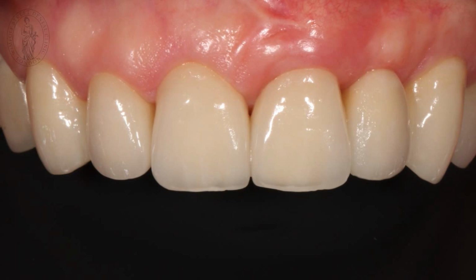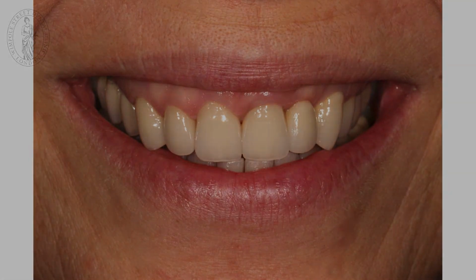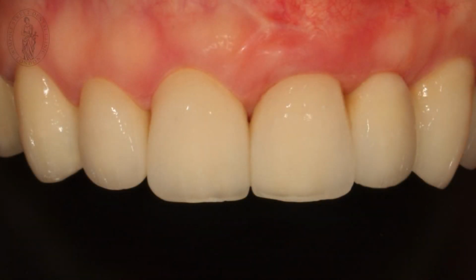So you can see here in the detailed photograph that the margins are good, gum looks good, and yeah, it looks like natural teeth actually. And again, the gum between the teeth will adjust, but that will take half a year after placement. And the patient, of course, was very happy with the result. Here I've taken a picture without a flash, so you can see the different layers of the ceramic, especially on the incisal edge, where you can see a little bit of translucency, so that we can actually pretend to have natural teeth.